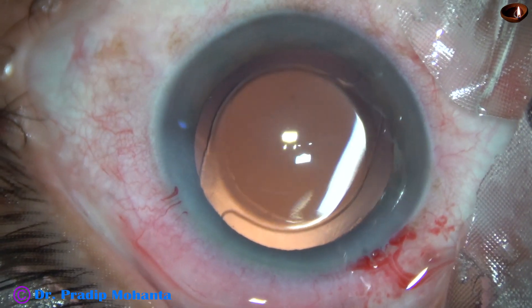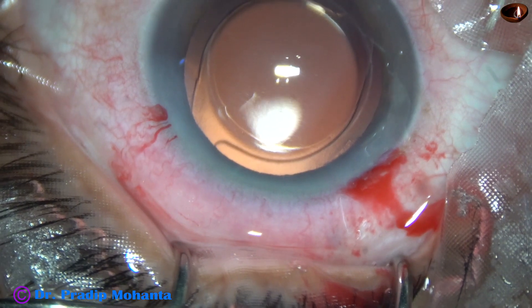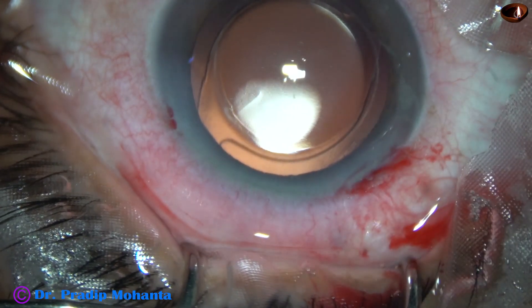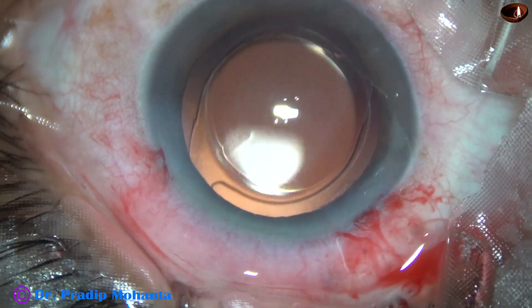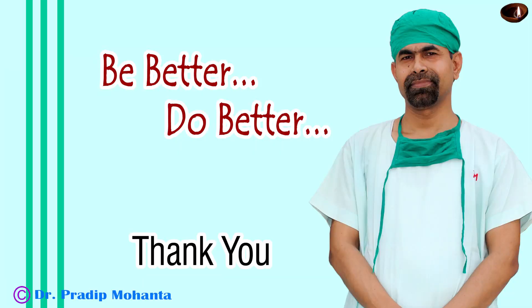The integrity of all the wounds is checked. A few drops of moxifloxacin are applied over the ocular surface and the case is concluded. Thank you very much for your attention. This was a routine surgery, but routine surgery is not to be neglected. We must do routine surgery with more command and with more safety, and in this way we can give very good results to our patients.